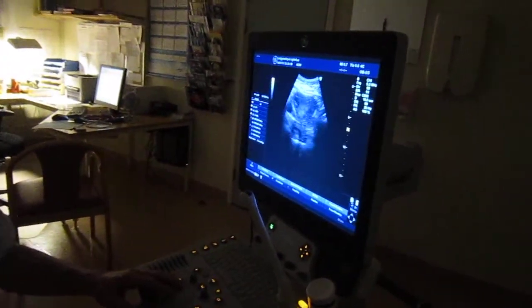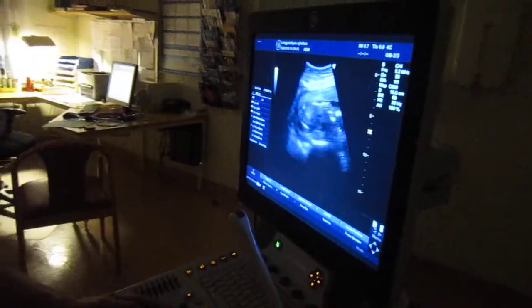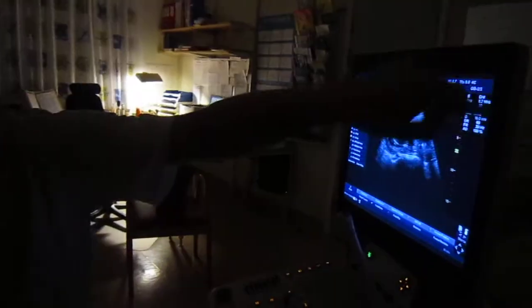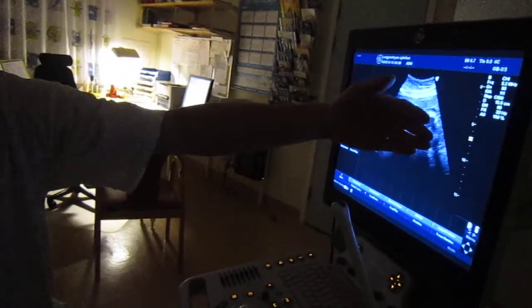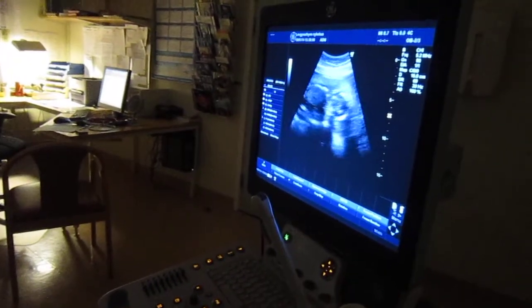So before I say too much, I just take an orientation here, okay? What I'm going to show you now, when we look at this, then your stomach is here, and your head is up here, and your legs are down here. So when we look straight down here with the ultrasound, we make a cut down on the baby, okay?